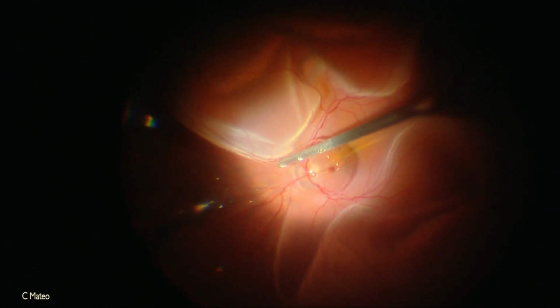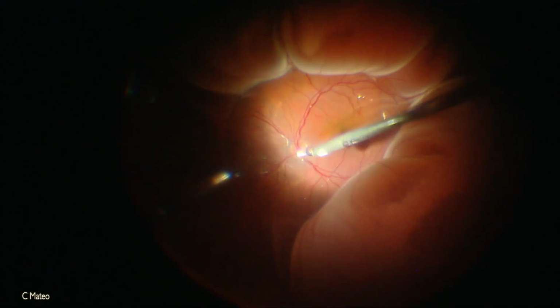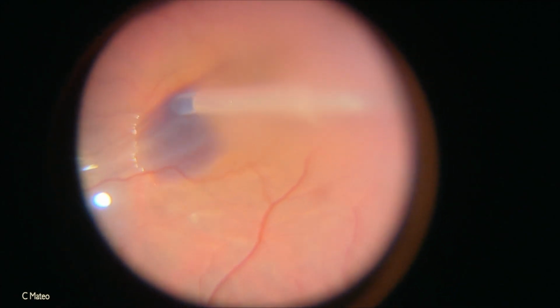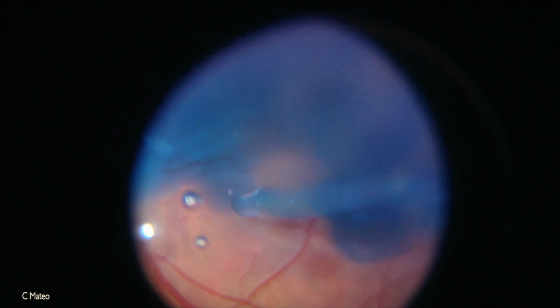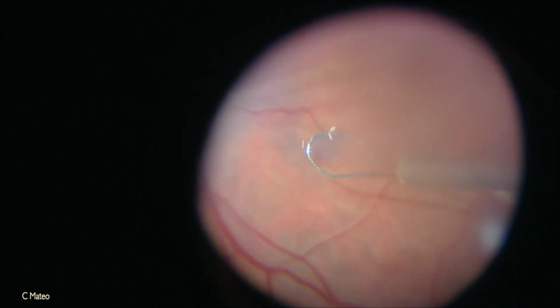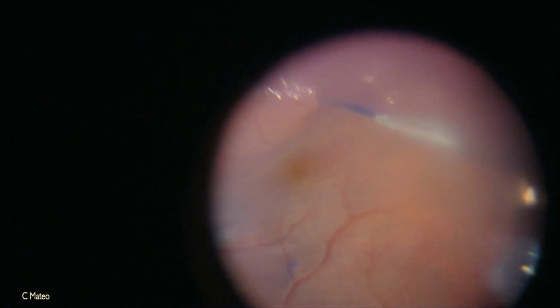Although there is no scientific evidence, I always remove the ILM to smooth out the retinal surface and to reduce the risk of epiretinal membrane formation after surgery. As you can see, we stain under perfluorocarbon liquid, which produces instant dyeing, and with gentle retinal massage we help to open the macular fold. The ILM is then removed in a larger area than we peel in mid-sized macular holes.